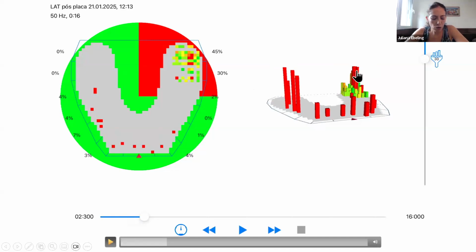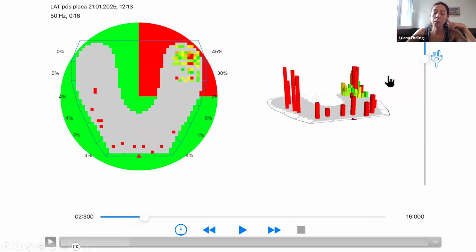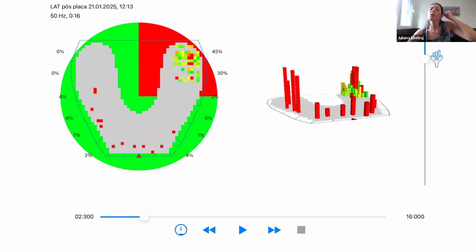This patient also has a click on this side of the joint, on this left joint. This is related to this contact. It's an overload over this joint during this movement. Remember that this left joint is the side that makes the movement for the right lateral movement.